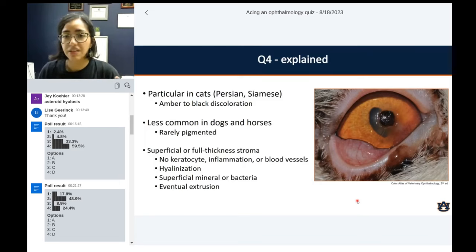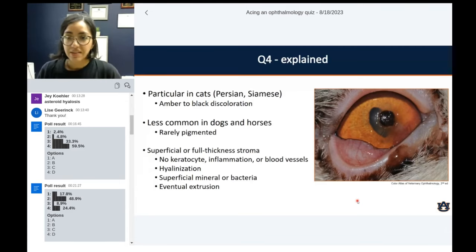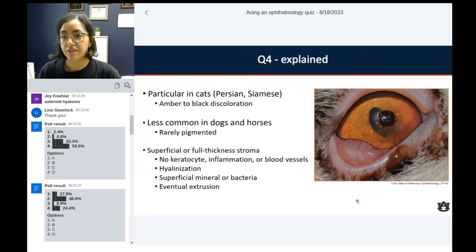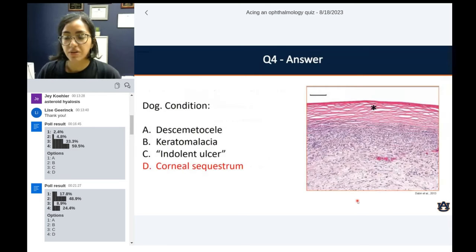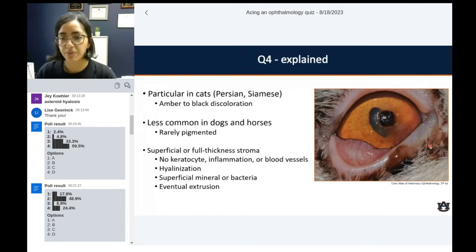There won't be any viable keratocytes — you just see stacks of hyalinized collagen with that vitreous appearance to it. Because it's really desiccated, dense tissue with no viability, nothing gets in and nothing gets out. Inflammation, if it happens, will just stop at the border of where the sequestrum is starting — no inflammatory cells can get through it. It's basically devitalized tissue. The hallmarks are: stacking, lack of viable cells, no inflammation or blood vessels, and hyalinization — characteristic of sequestrum.